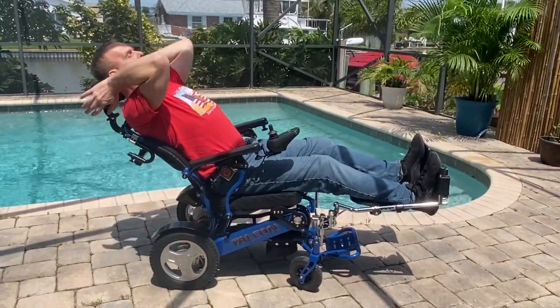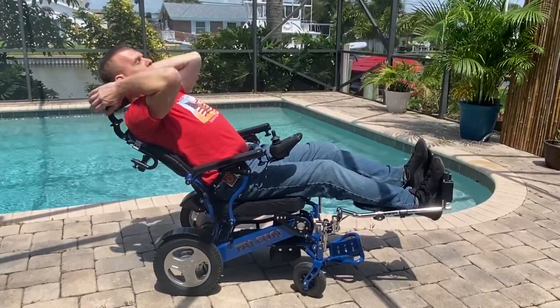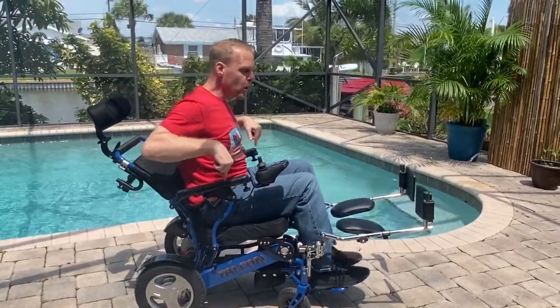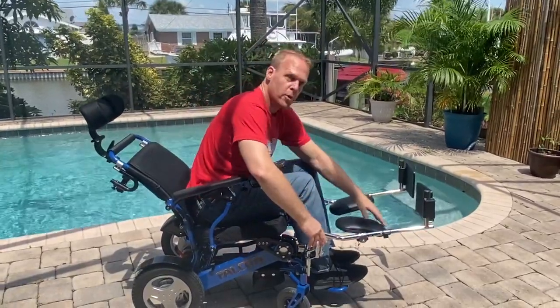The headrest is exceptionally comfortable, with multiple areas that I can adjust. This chair itself holds up to 400 pounds.